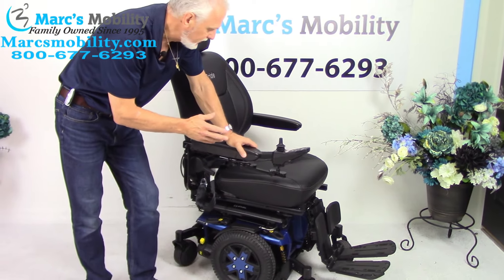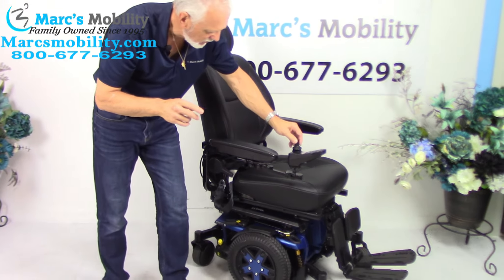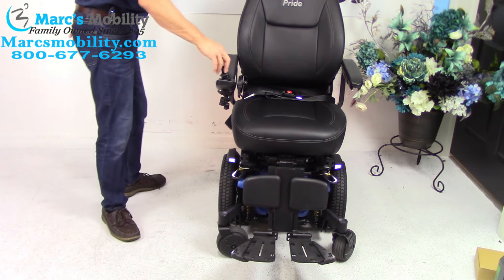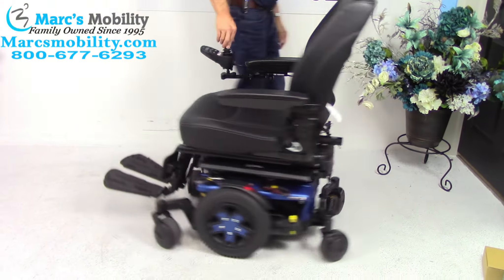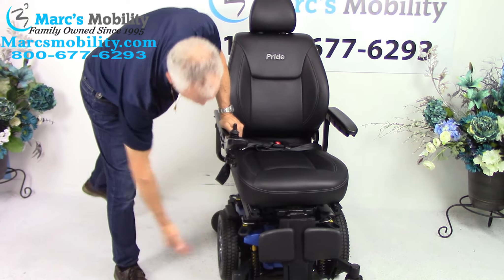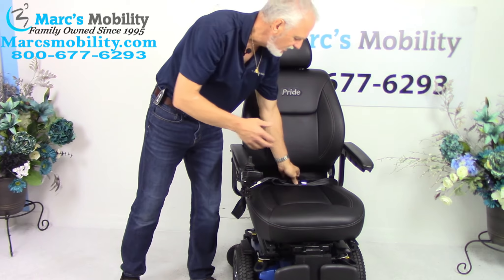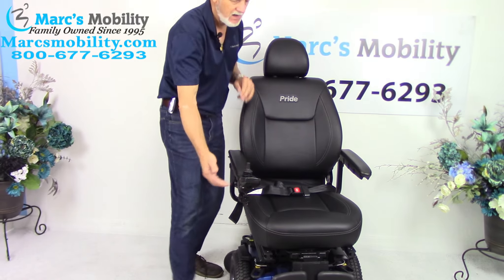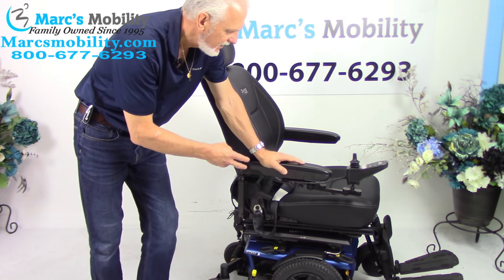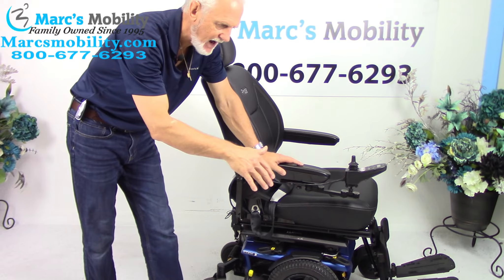Let's recap: this is a Quantum Edge 3, used only a month or two — practically brand new. The seat is 20 by 20. It also has the light kit — there's a button right here and you'll see your front and back lights. The chair is equipped with headlights from the factory. It has a swing-away joystick, flip-up arms, 20 by 20 seat, safety belt, adjustable back, adjustable foot plates, manual controls, great suspension, two batteries, front charging, and about 14 miles of range per charge.